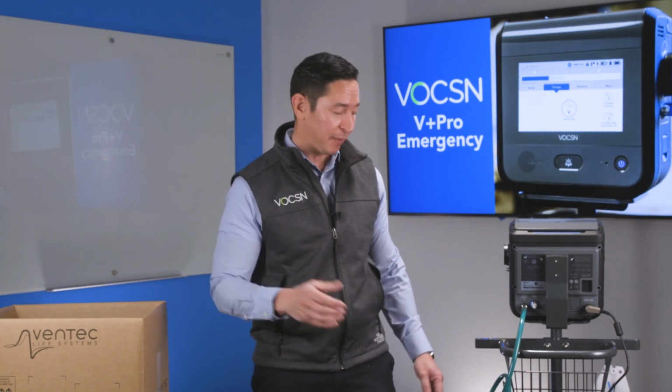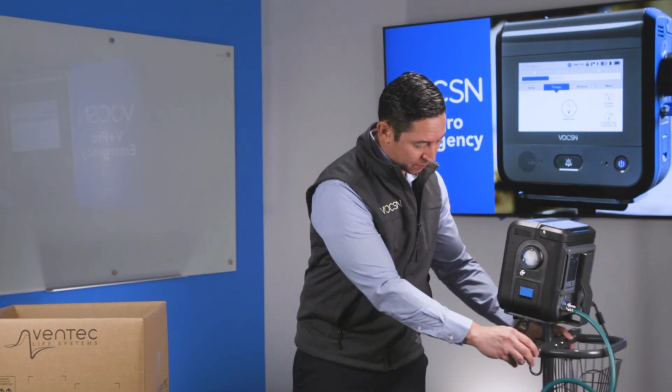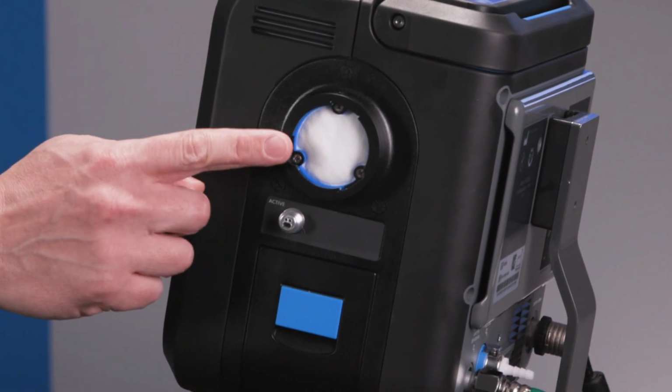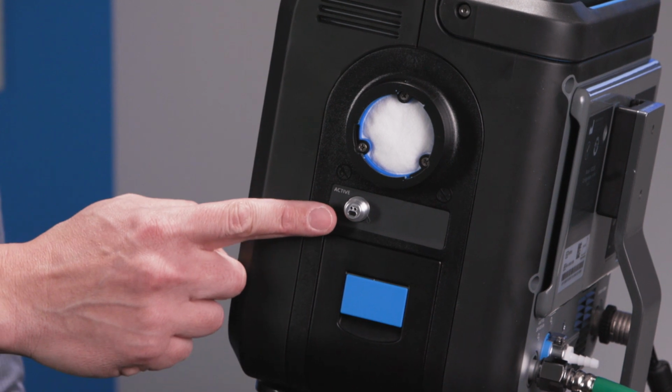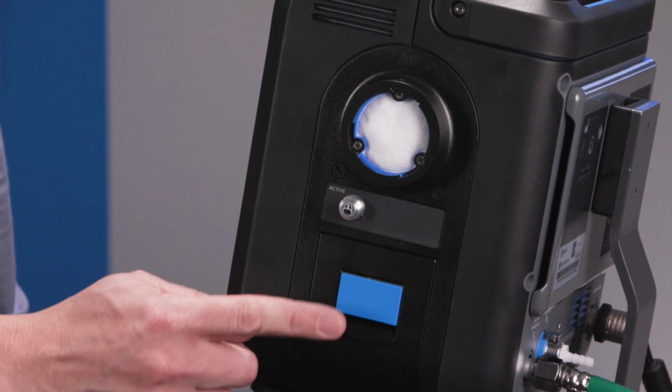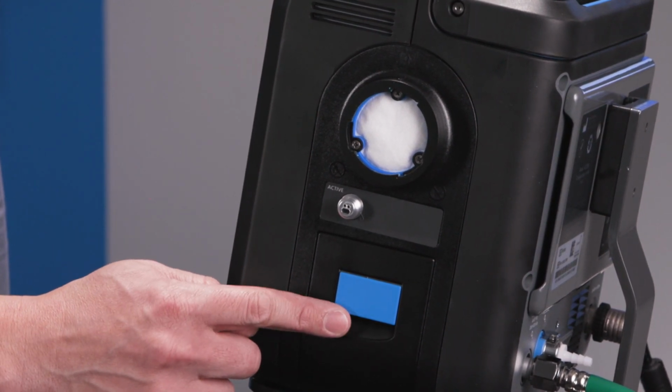The next thing I'm going to do is spin the device around so I can show you how to connect a circuit. So we have an internal bacteria filter right here. That's where our external bacteria filter will go. We have an active porting block right here. And then we have one of our removable rechargeable batteries as well.